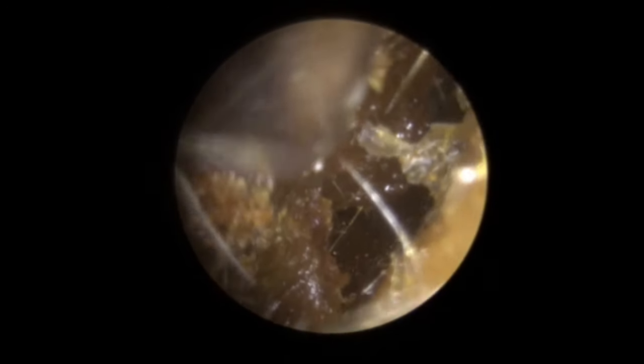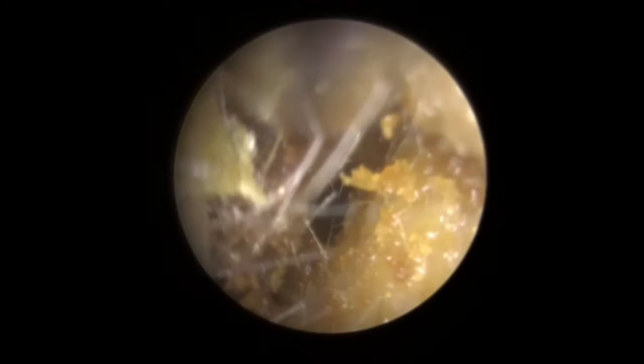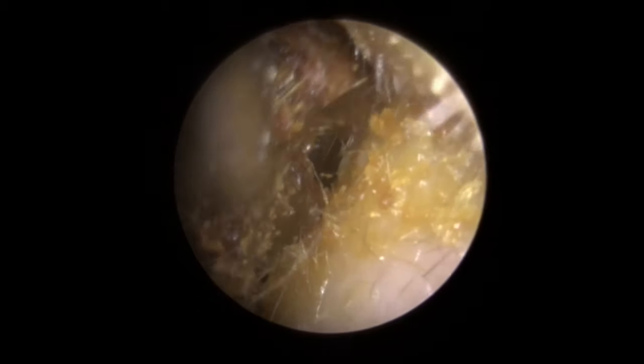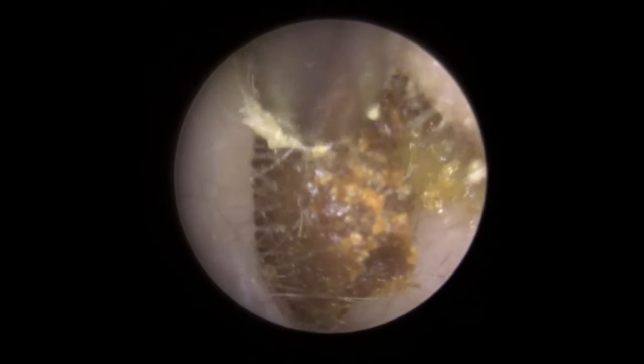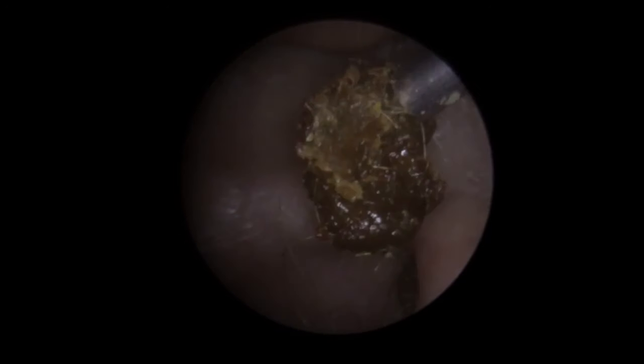So we're just going to move it around. The top section has come away really nicely — a little bit too big to fit out, so it's got jammed in the entrance to the canal. Just giving it a bit of a wiggle, trying to free it up a little bit. Really trying to wiggle this down — and out it pops. So you can get a good look at it there. This does happen — we do drop these things every once in a while. Landed in the bowl of the ear, so we picked it back up again.